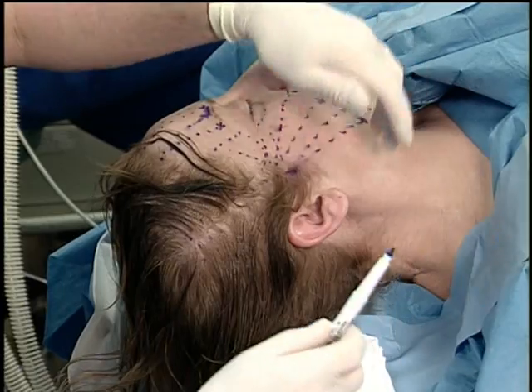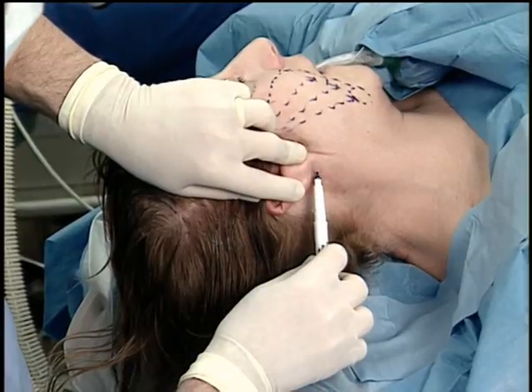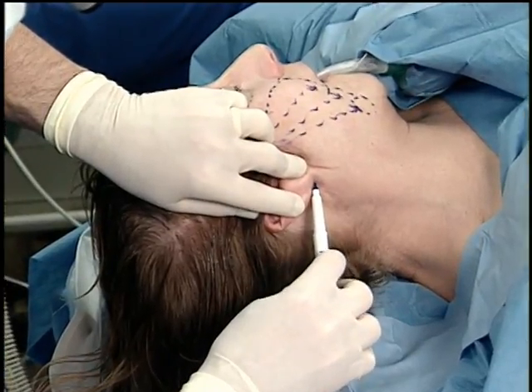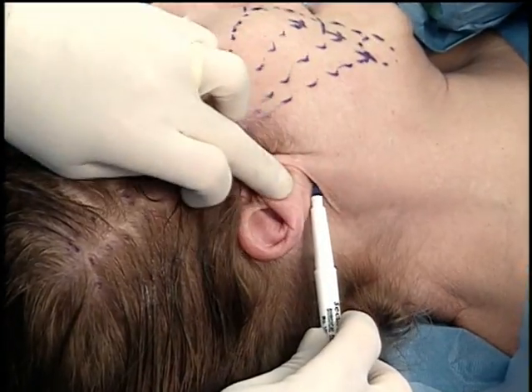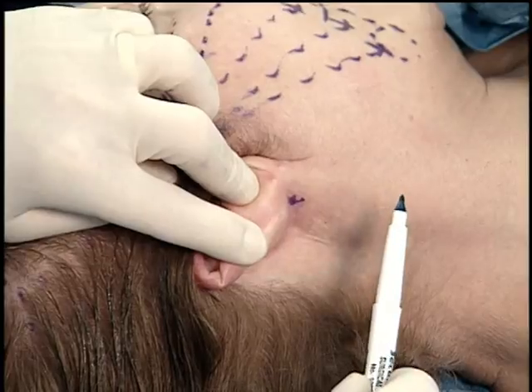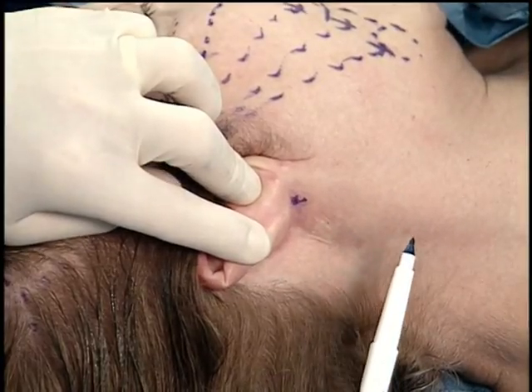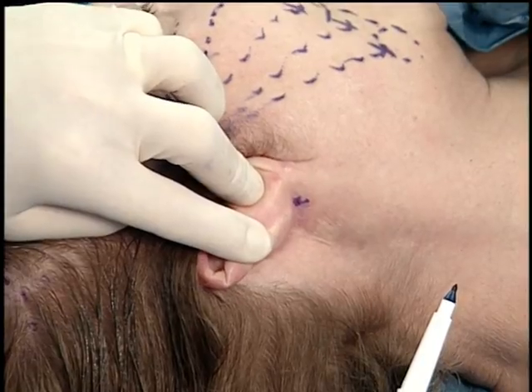We're now going to come out from under the ear lobule. There's an infralobular deployment port, an anchor port. Make sure it's hidden right in the infralobular space there. By staying anterior just under that lobule, you will avoid, in a great number of instances, the anterior branch of the greater auricular nerve.